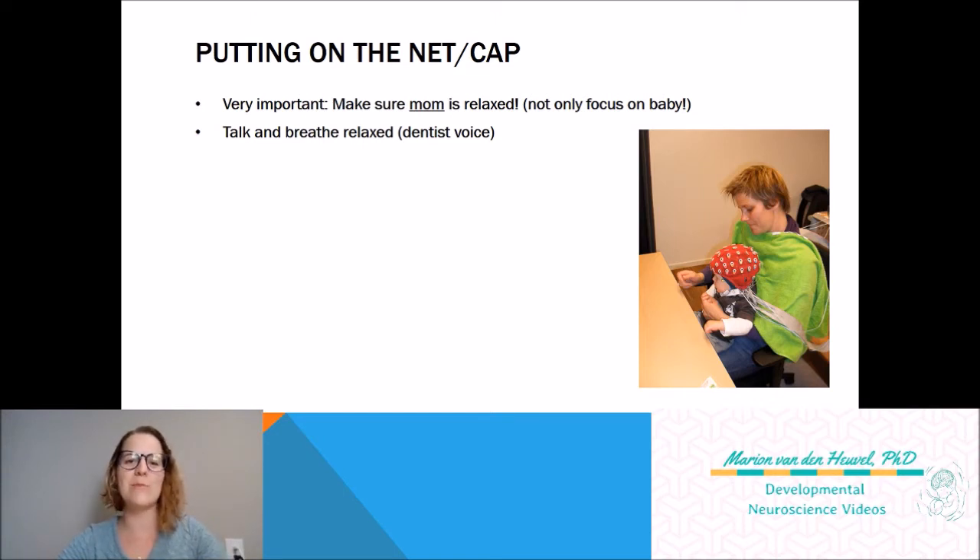I always talk to my students about the 'dentist voice.' When you're at the dentist, you notice that your dentist always tells you what is going to happen — like 'okay, now I'm going to apply this here, and this might tingle a little bit.' This is exactly what we do with the EEG. Obviously the baby doesn't understand it, but it's more for the mom — you're really focusing on relaxing mom. When you apply the cap you say things like 'okay, now we're going to apply the cap — oh, doesn't that look cute!' So you tell mom what's going on as you're doing it, just like the dentist does.